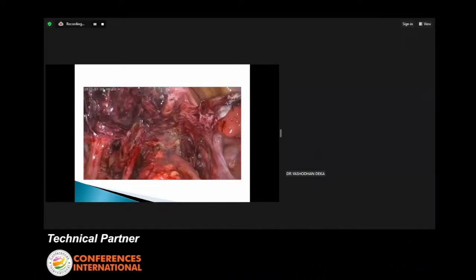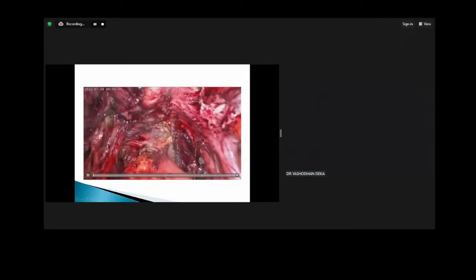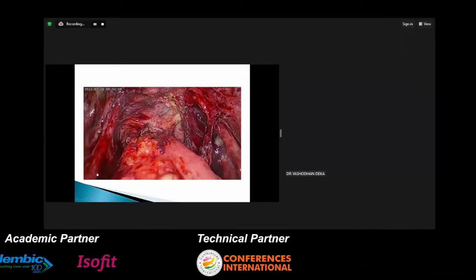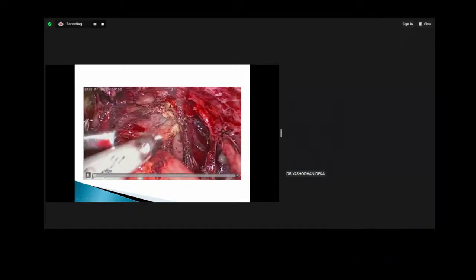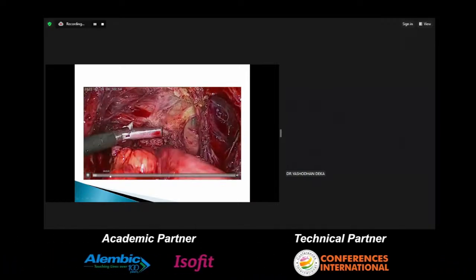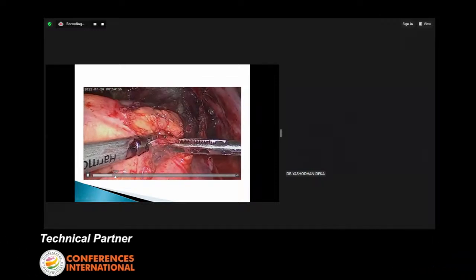Similarly, in this surgery, we have already done the required dissection. Although the size of the lesion appeared small, what has happened is that the lesion was subocclusive. So once you have dissected it completely, we have mobilized it completely, and you have to defat it.